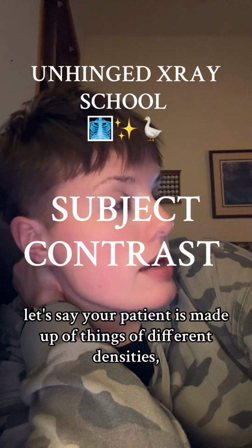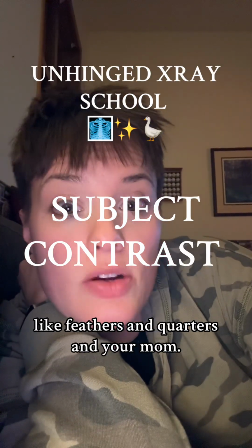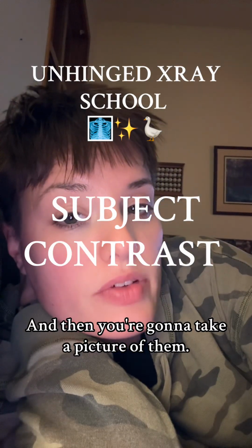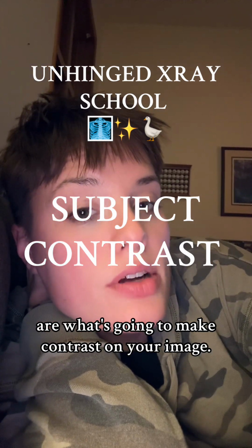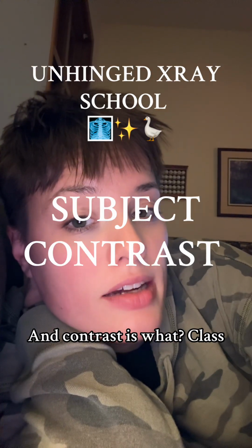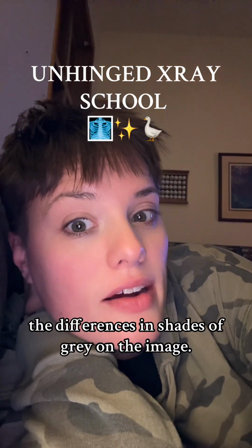Delicious. Let's say your patient is made up of things of different densities, like feathers and quarters and your mom. And then you're gonna take a picture of them. Different densities inside that patient are what's going to make contrast on your image. And contrast is what, class? The differences in shades of gray on the image.